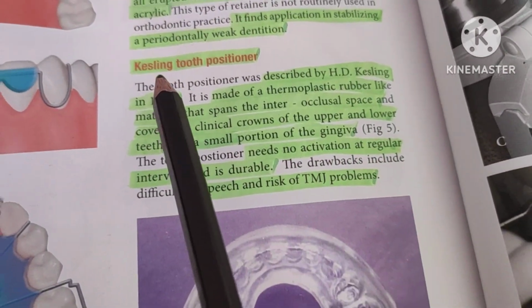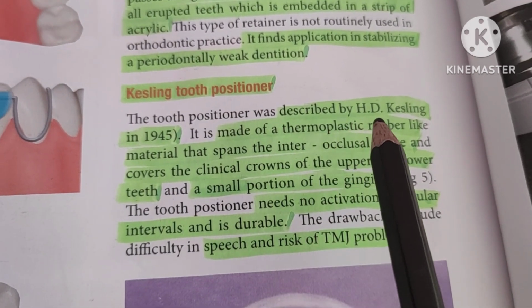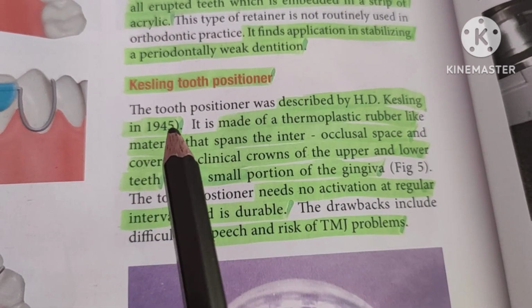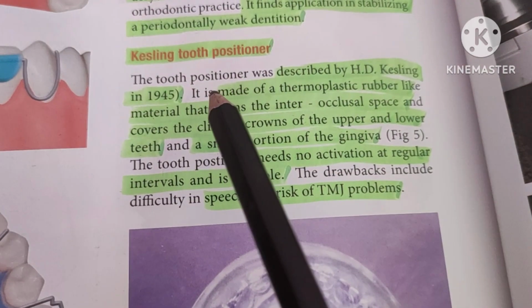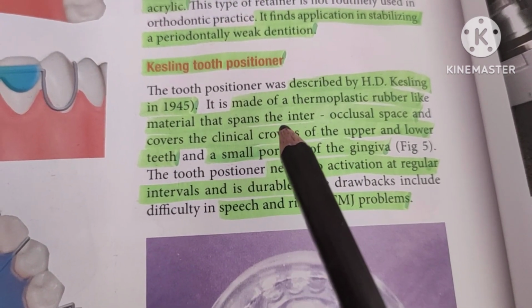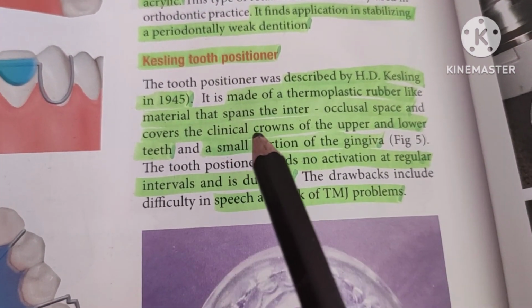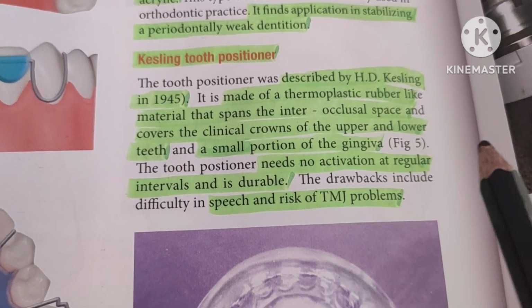Now next is the Kesling tooth positioner. The tooth positioner was described by H.D. Kesling in the year 1945. Here we can see the Kesling's tooth positioner. It is made up of a thermoplastic rubber-like material that spans the interocclusal space and covers the clinical crown of the upper and the lower teeth and a small portion of the gingiva as well.